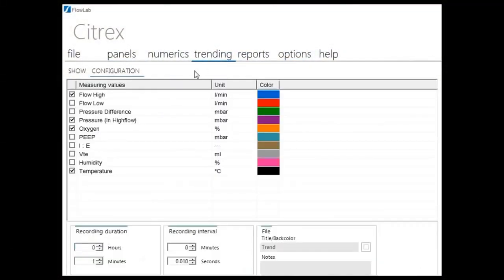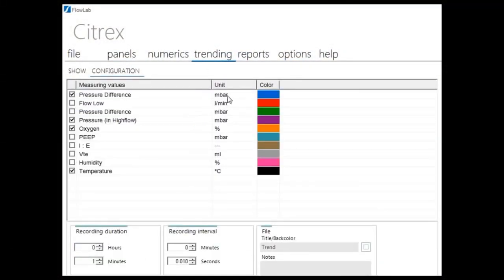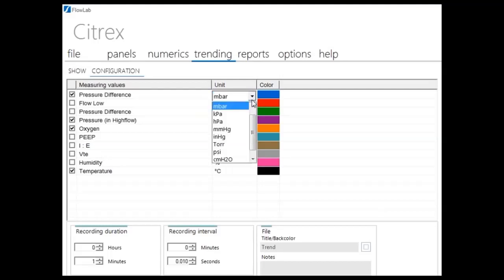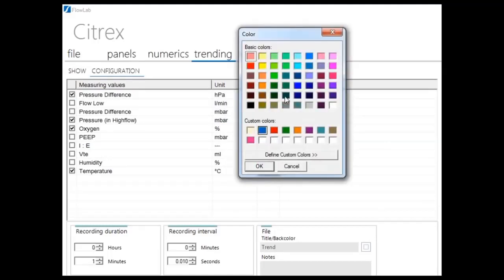FlowLab offers trend features for a recording time of up to 100 hours. Set the duration, the interval, and up to 10 parameters you want to record.